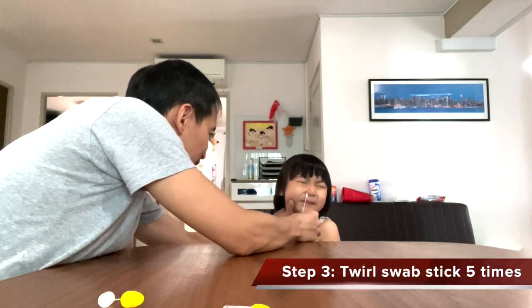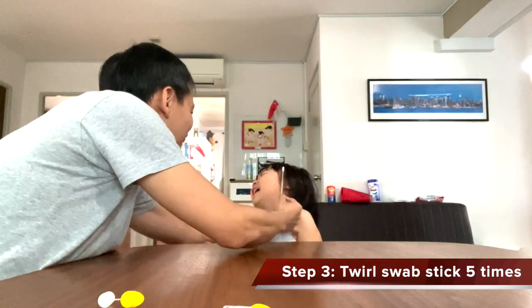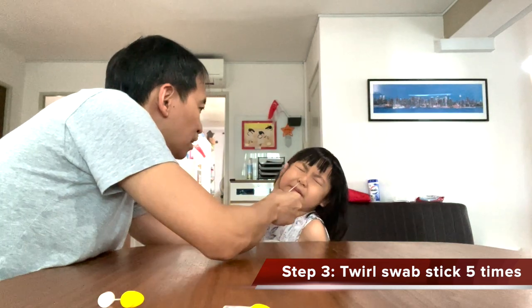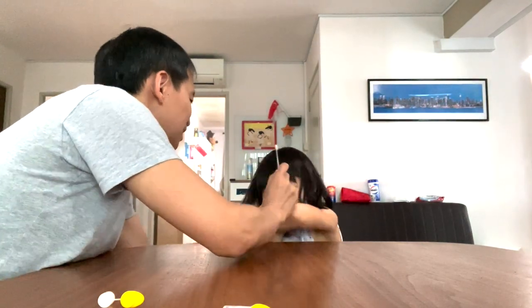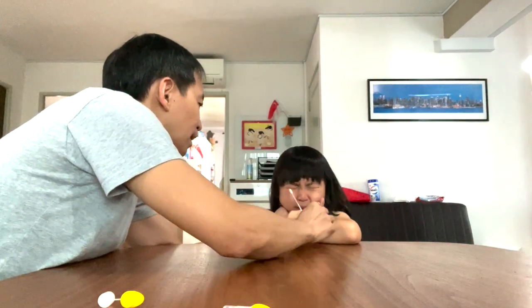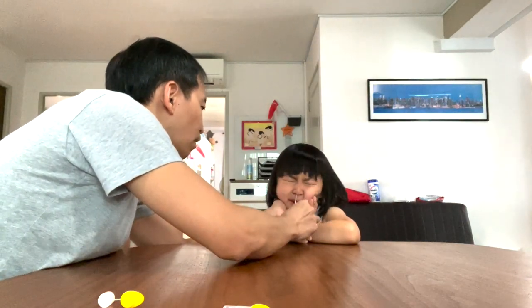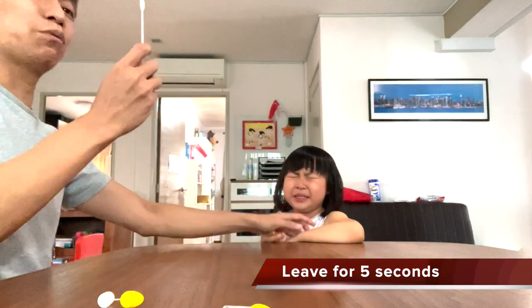Are you laughing or crying? Don't move, don't move or it will hurt your nose. Okay. That's one twirl. You can breathe. Two, three — okay, two more times — four, five. And let it stay: one, two, three, four, five. Okay. That's one nose.